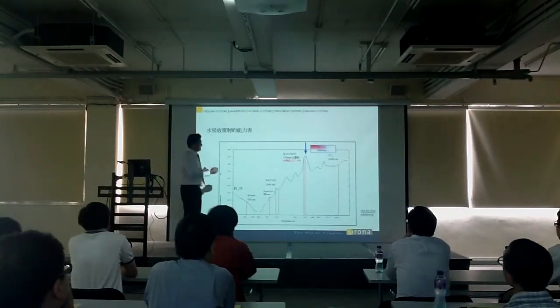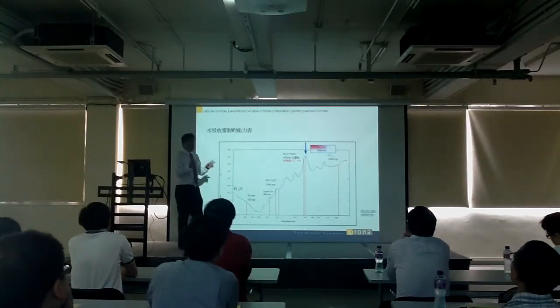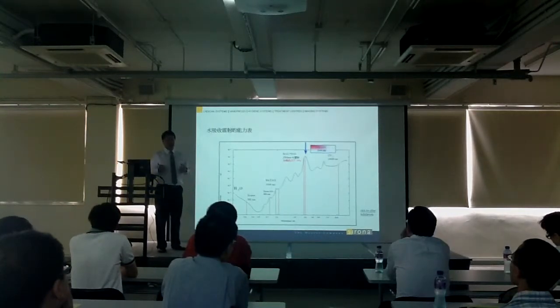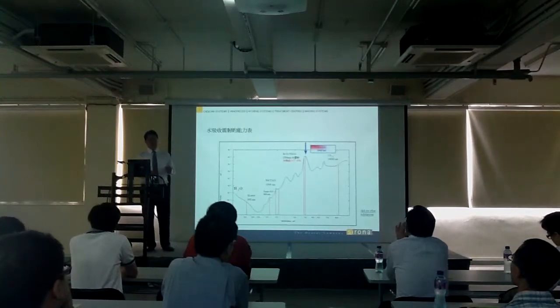This arrow means erbium YAG. This red line on the side is erbium chromium YSGG. By physics, not any trick or any claim that any company wants to tell you, by physics, the YSGG laser is less efficient than erbium YAG. How much? By 55%.